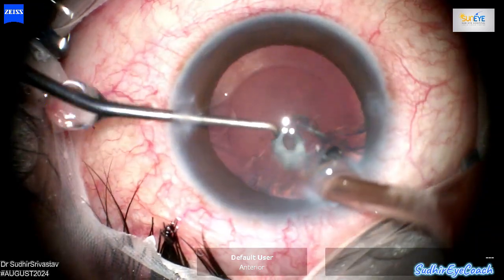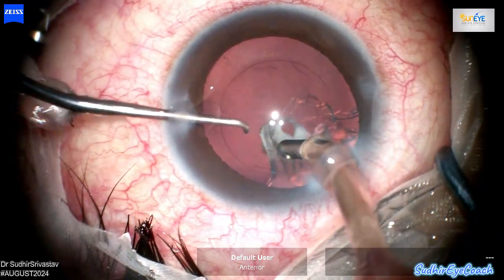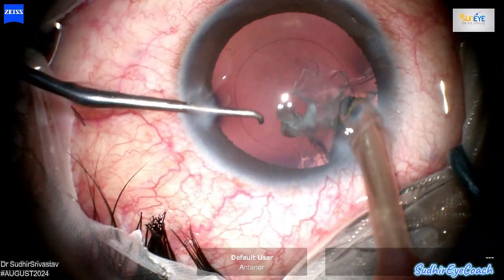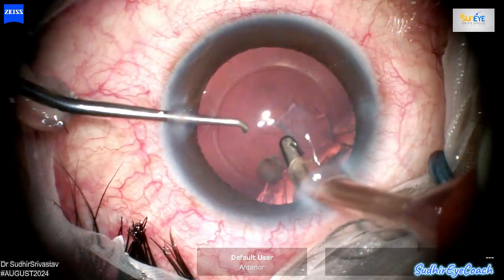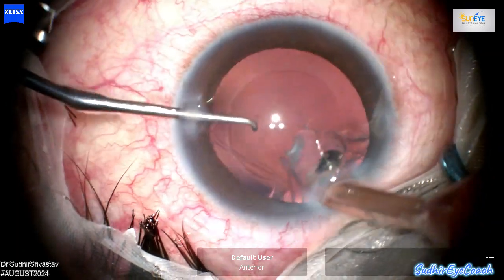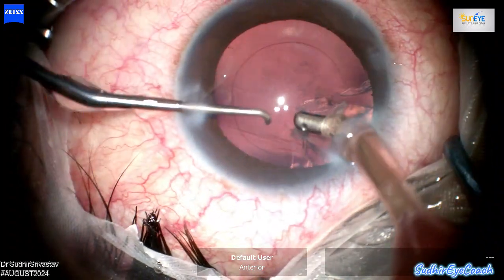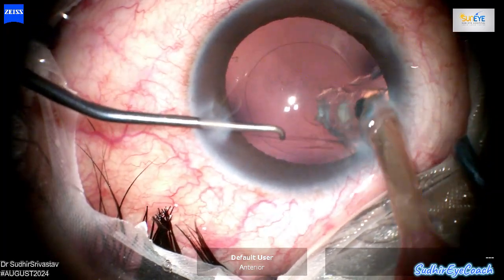Here I am aspirating the cortical matter while carefully keeping the tip away from the posterior capsular tear. I am focusing on the removal of as much cortical matter as possible while continuously monitoring the posterior capsular tear. My goal is to prevent any extension of the tear and avoid engaging the vitreous. Chamber stability and maintenance is very important here, especially when using lower intraocular pressure settings, to minimize fluctuations and avoid potential complications.